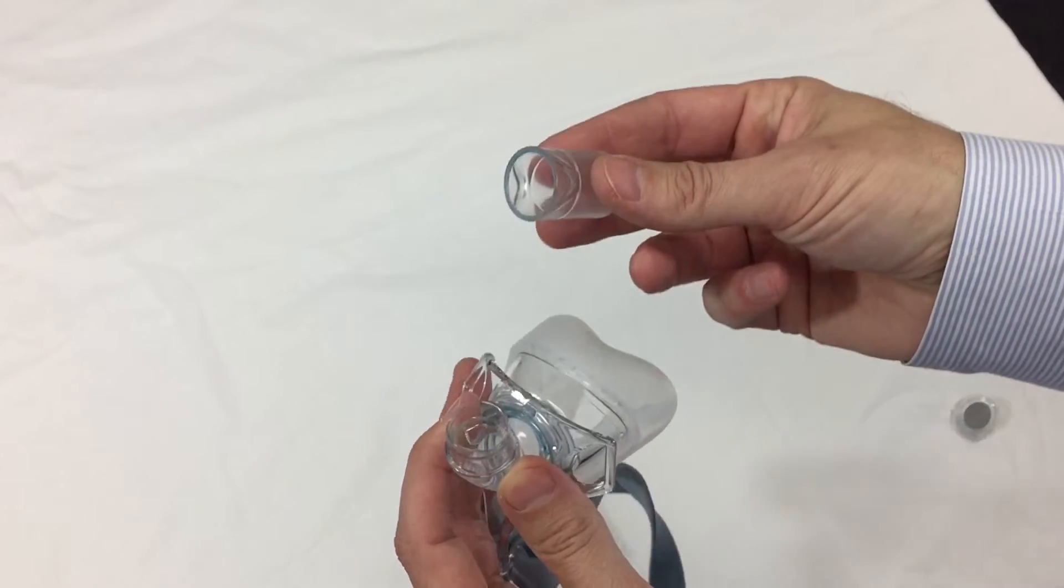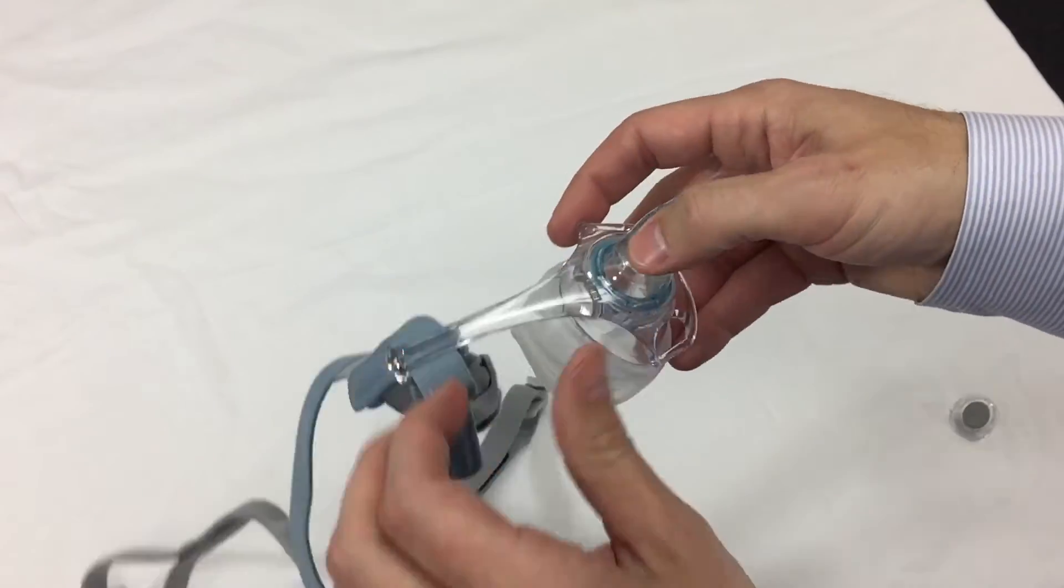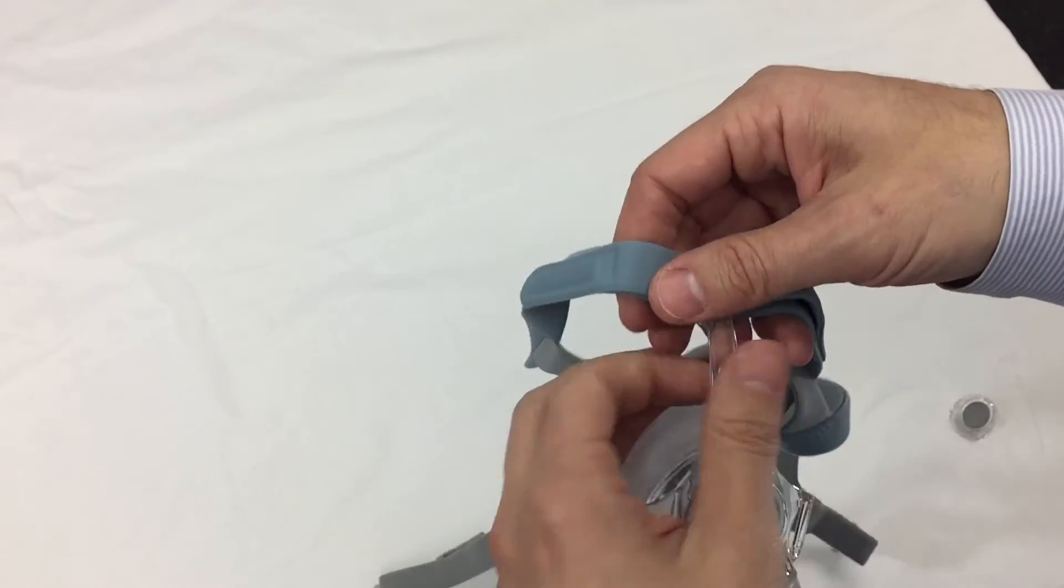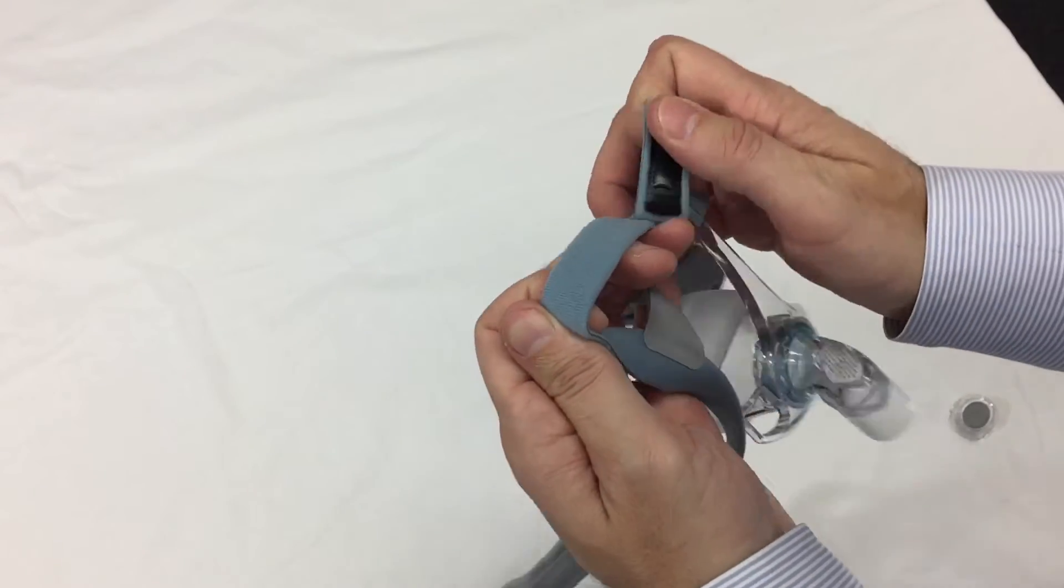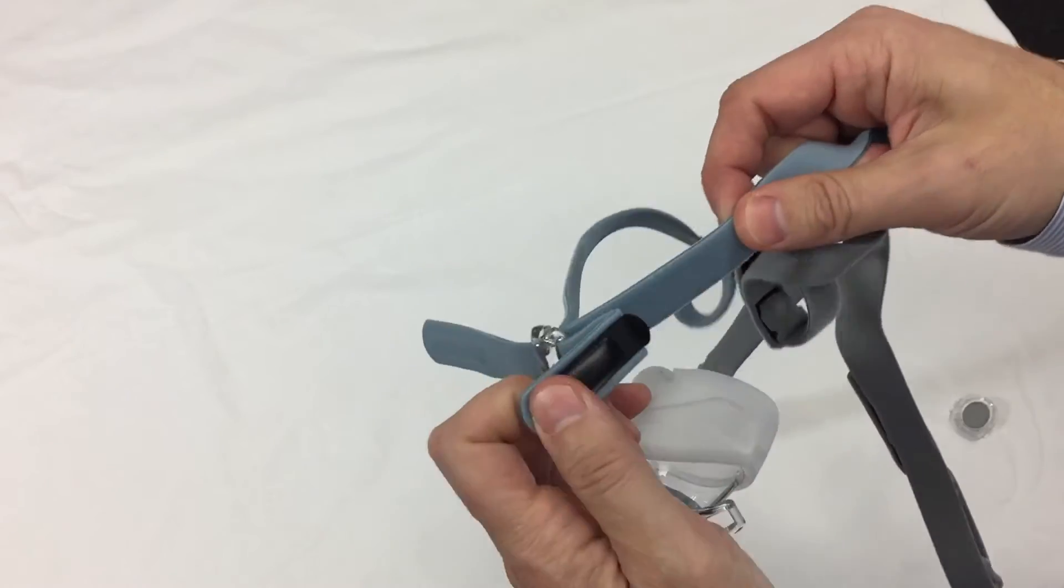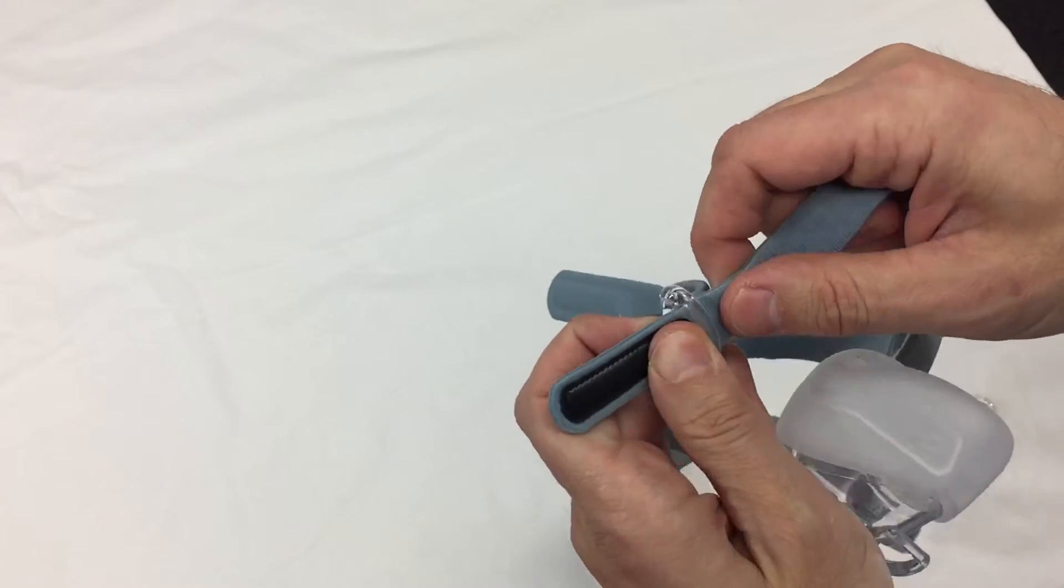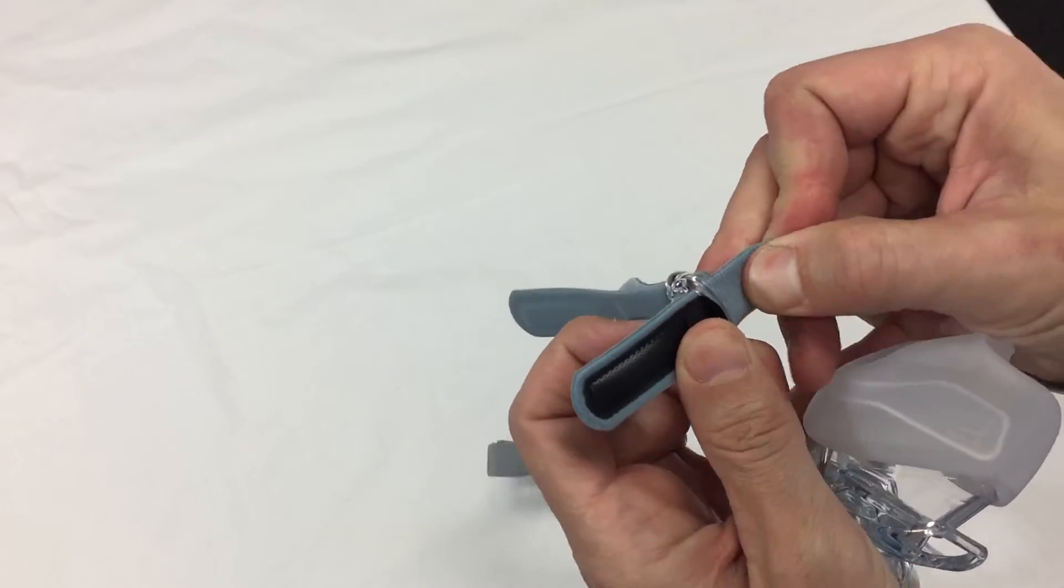And the elbow pops off. And that spins around. This mask will work with any CPAP or BiPAP or VPAP machine by any manufacturer. And it will connect to regular standard tubing or heated tubing. Works with anything.